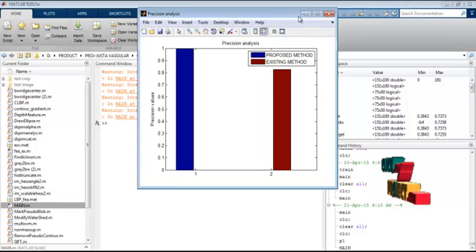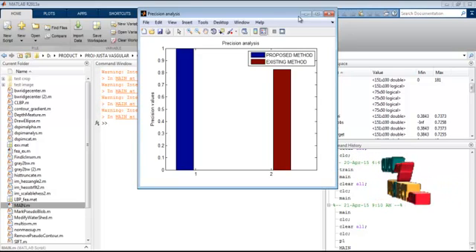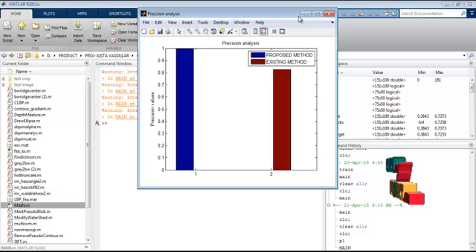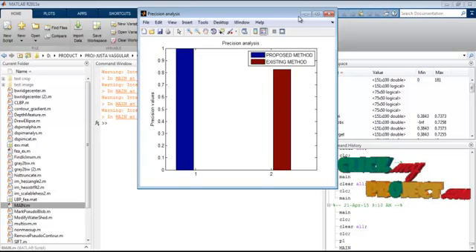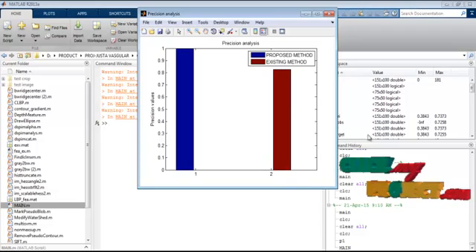These analysis results are mainly for classifying the multi-SVM based classifier results and classifying the overall database against the input image for classification performance level, and to calculate the precision and recall, then the accuracy level of the overall process in our lung nodule based classification methodologies. These results are applied for the overall process.